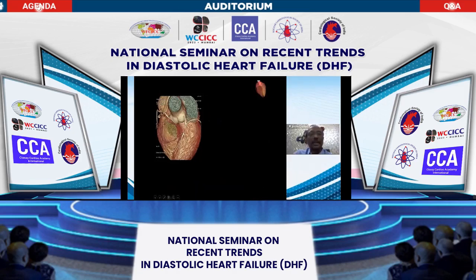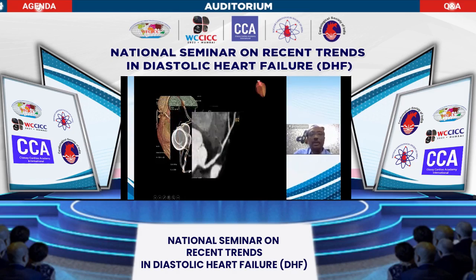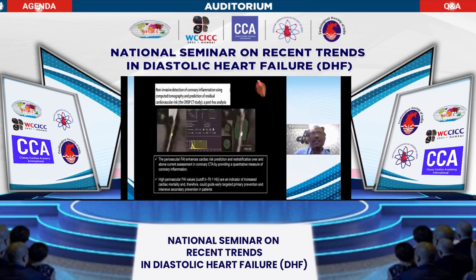At the end of the day, the idea is to pick up the lesions and modulate or start the treatment when there is positive remodeling like it's seen here. And we do not wait till the patient goes on to develop a vulnerable high-risk plaque which has ruptured and caused stenosis.